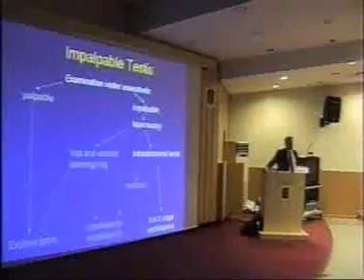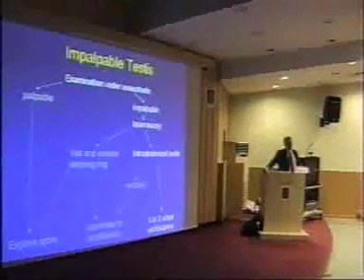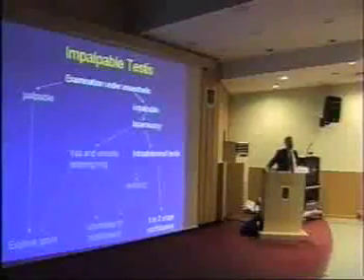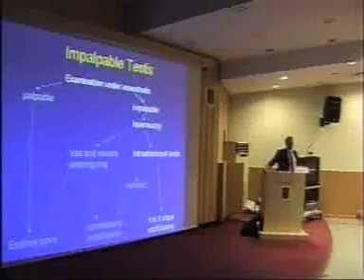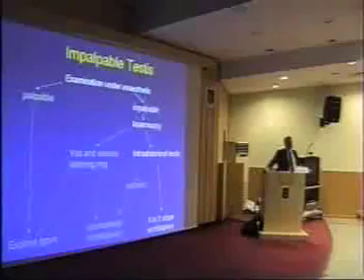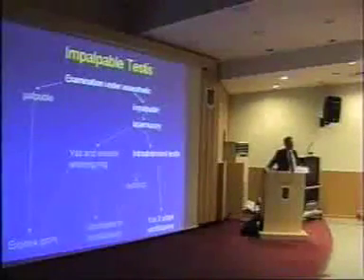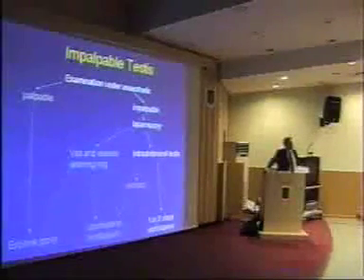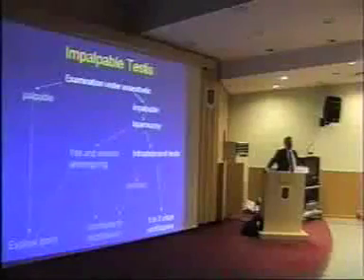In the abdomen, you've probably got 200, 300, 400 cc's of space in a 1-year-old child with your pneumoperitoneum. In the equivalent situation, retroperitoneally, you've probably got 100 cc's of space. And the room for manoeuvre of your instruments is less, and the potential of clashing of the instruments is greater. So I think that in the ideal world, you'd start off transperitoneally and then you'd try it retroperitoneally.